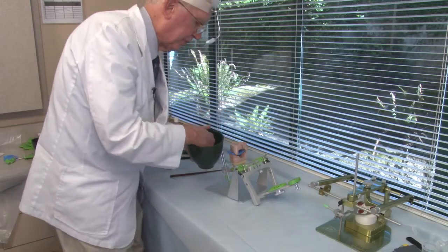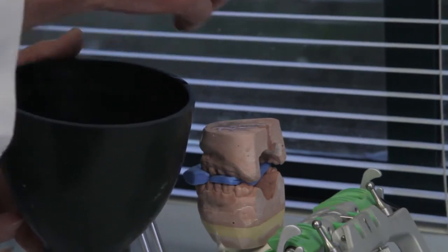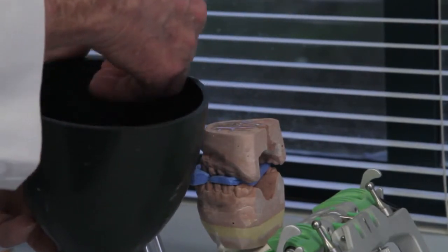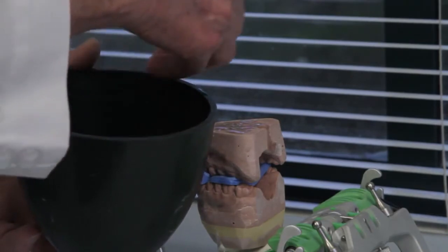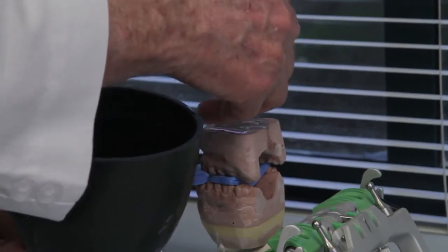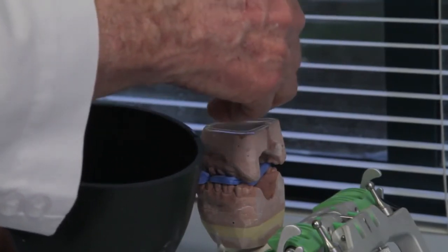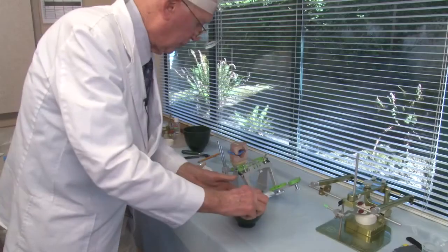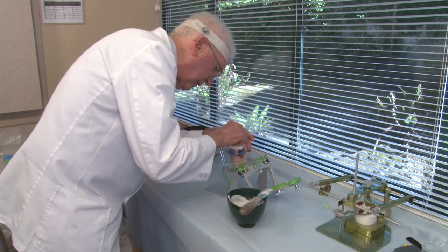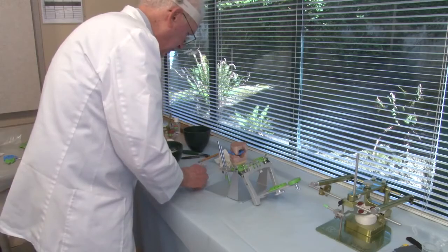If you don't wet the base of the lower model, or any model, when you add plaster, the dry model takes water out of the plaster that you're adding, and thus the union is not as strong then. So you don't want your model taking water out of the mounting plaster that you're going to add. Otherwise the union will not be as strong. I want to take a little bit of the excess water off the lower model base. And then I'll start adding first to the lower model.